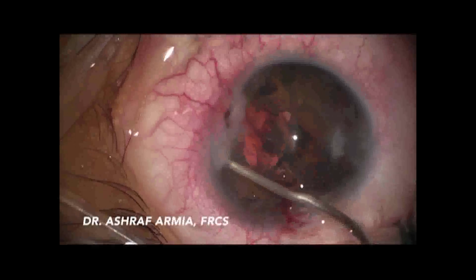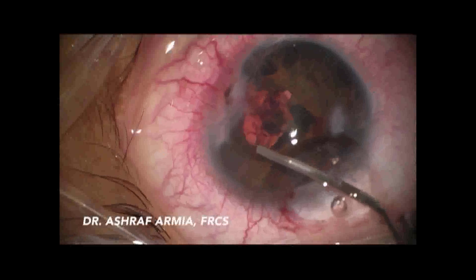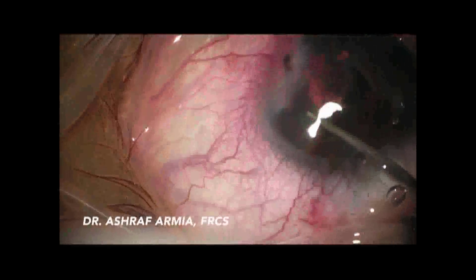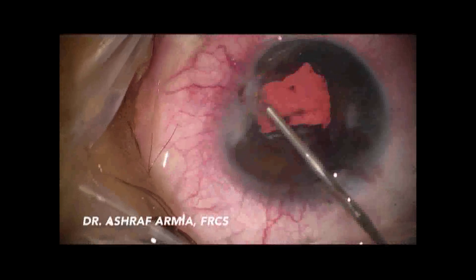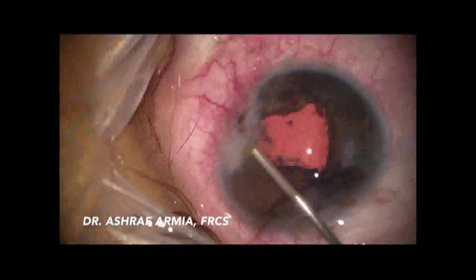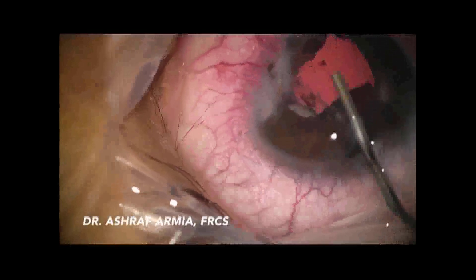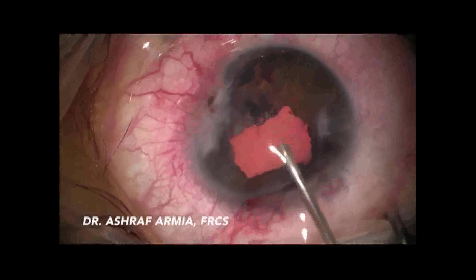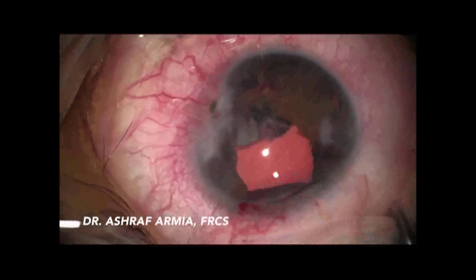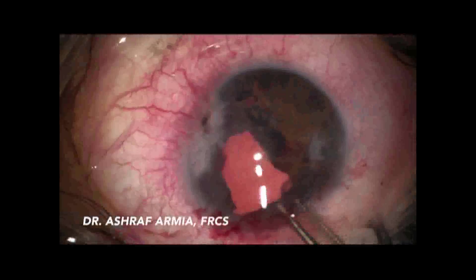Finally, I succeeded in making the foreign body freely mobile in the anterior chamber. I enlarged the wound to deliver the foreign body with forceps. It was a huge, rock-shaped, irregular foreign body with an orange color.